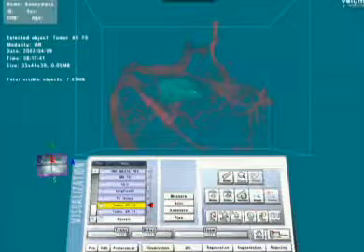Okay. With that, those are the two cases that I wanted to point out to you. Any questions you might have about this particular application?